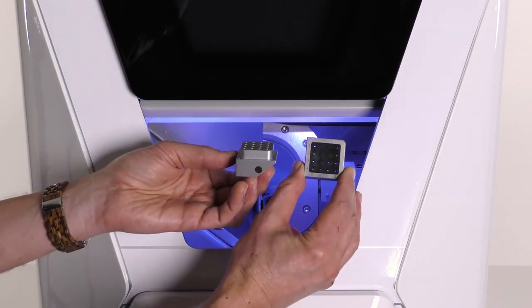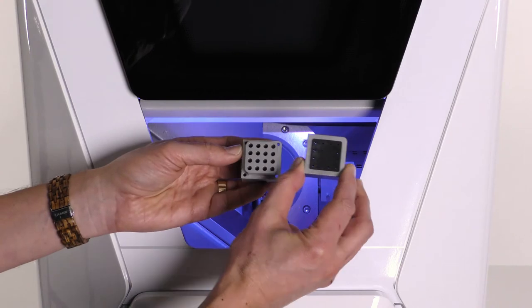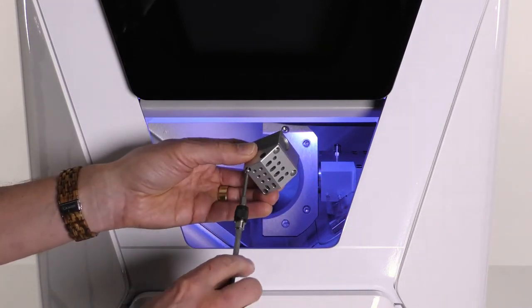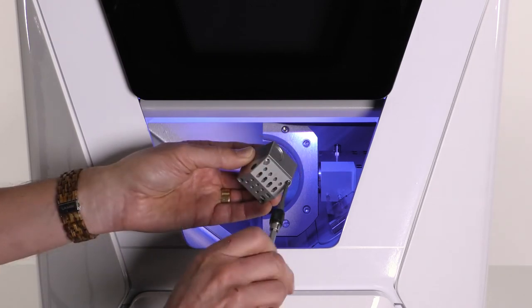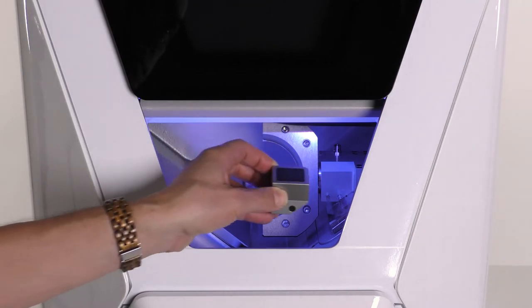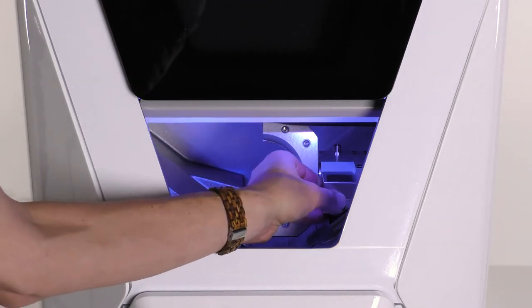Put the cover back onto the tool magazine exactly as shown in the video. Screw in the four screws diagonally. Remount the tool magazine in the working chamber.